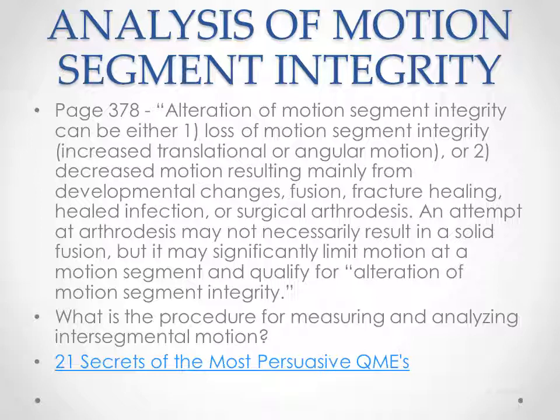So let's focus our discussion here on the angular motion, and let's go through some of the procedures for measuring and analyzing intersegmental motion. And for those of you that have the PowerPoint presentation, I've included a link here to another program where I go into this procedure in even greater detail than what I'm about to get into now.